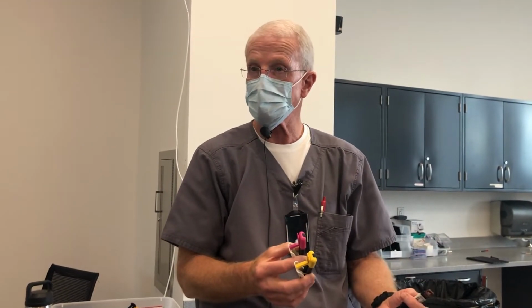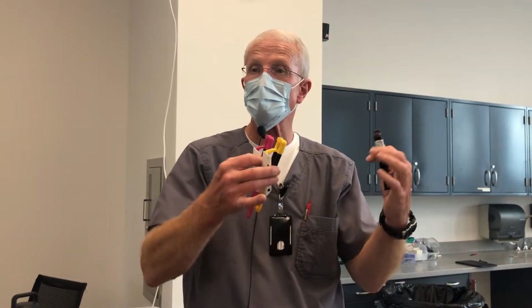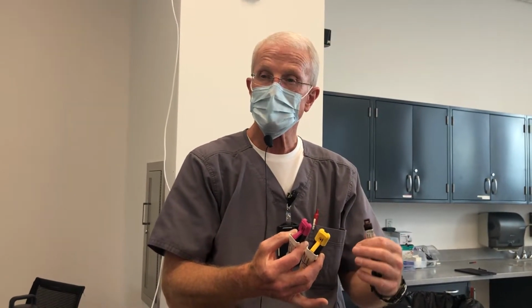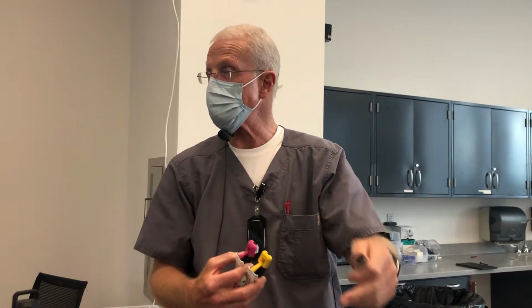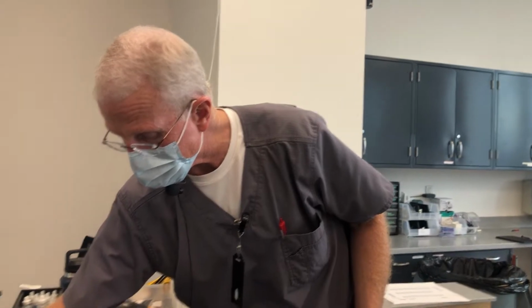But obviously cementing a crown, you don't want to do that. You want time to work with it. So you get it into place, and I like to just let them chemically set for several minutes and then come back, clean up the excess, and then hit it with the light for everything at the margins. Even if I have an opaque zirconia crown that doesn't let much light in, I'm going to at least get some light in there, and it will further polymerize and strengthen the material. If there's a light cure component, utilize it and you'll get better curing.